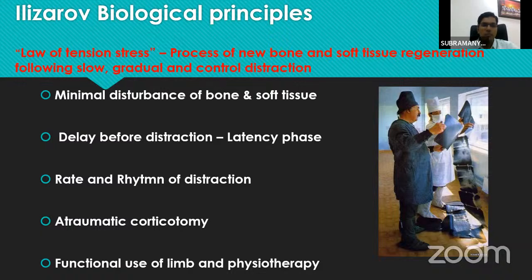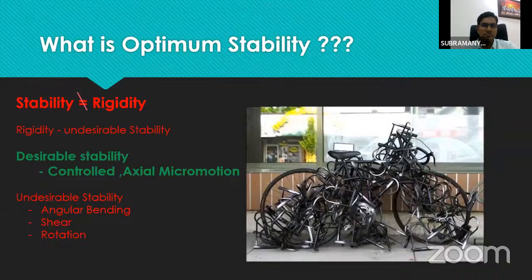of distraction, performing an atraumatic corticotomy, less injury to the corticotomy site, and always use a functional use of the limb and physiotherapy during the course of treatment.